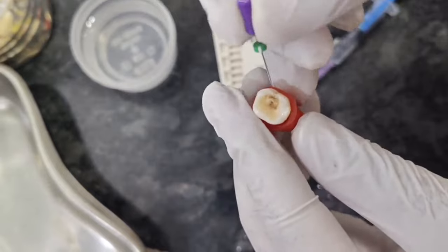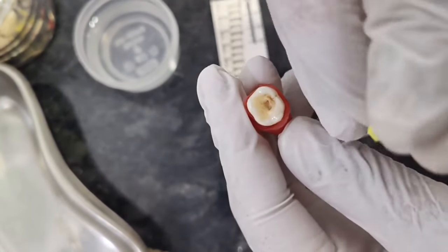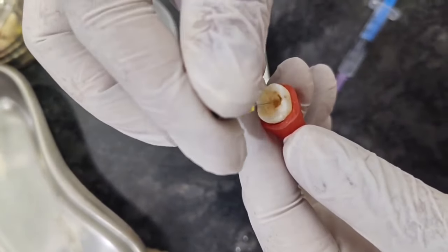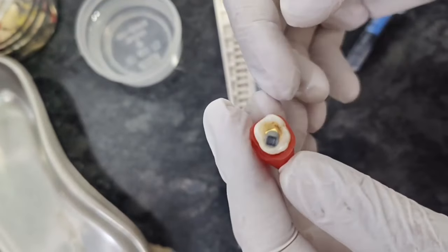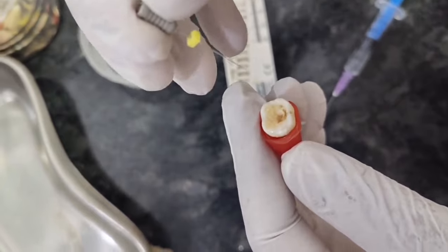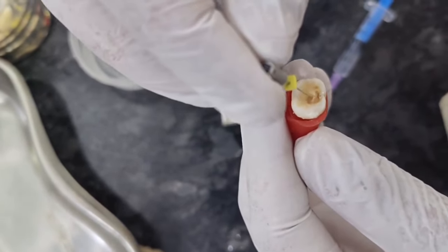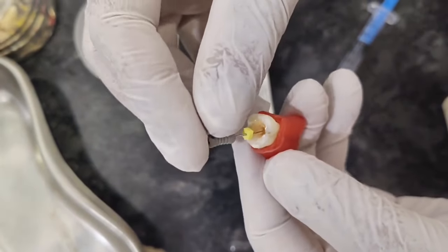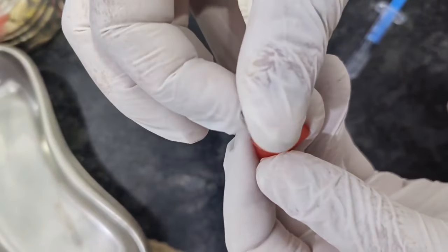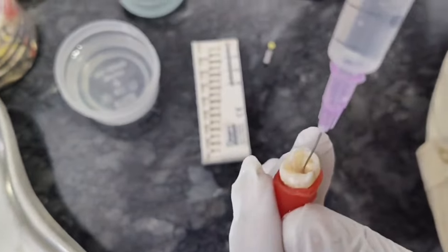Coming to the mesolingual canal. So this is the mesolingual canal. I just put the number 8 file, watch winding motion, take it out. Don't do too much filing, otherwise it may cause ledging of the canal. Now this is the mesobuccal canal I am using, see the angulation here. Watch winding motion, take out. Then irrigate each and every canal properly. Irrigation.